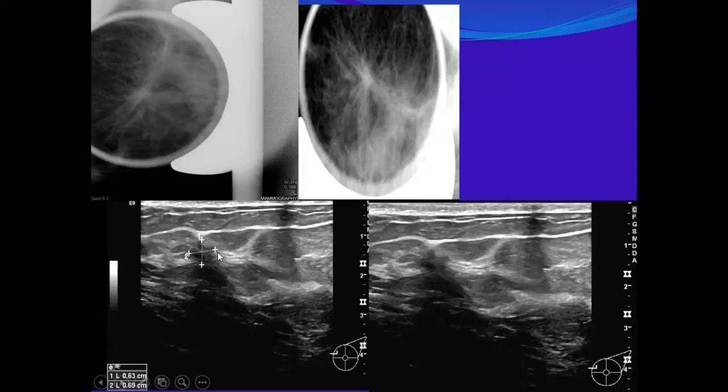And I called the breast surgeon. We have no facility for wire localization. We just targeted by ultrasound and drawing. We made a circle around it on the skin, and he removed it for her. And it was just early invasive.